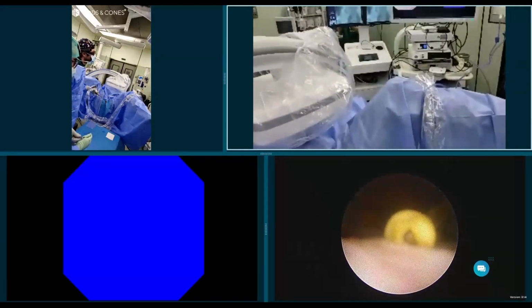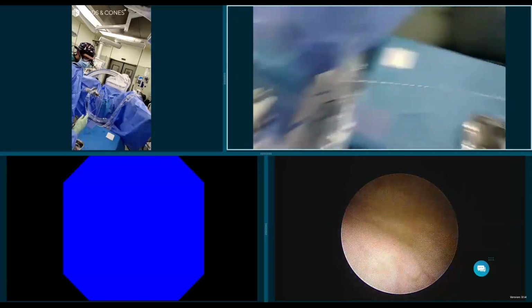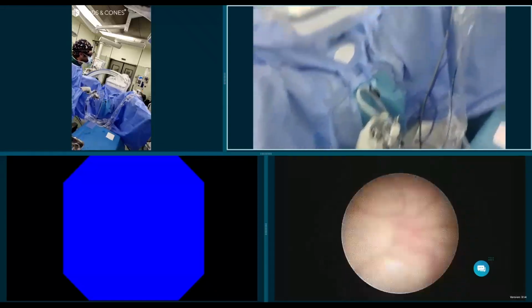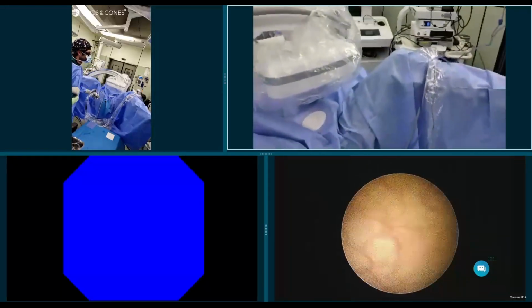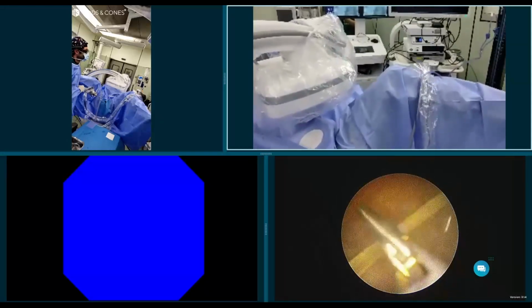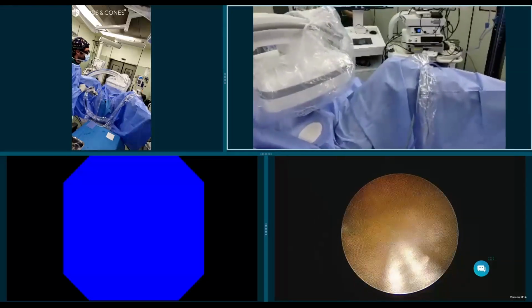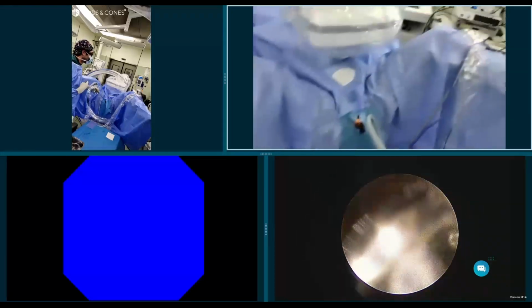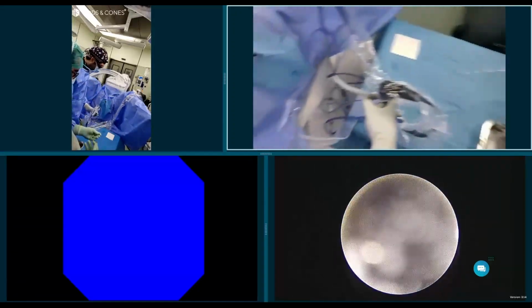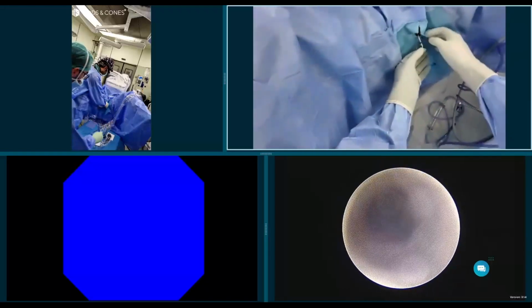I don't know if you saw that there's some incrustation inside the kidney. Let's take it out, and inside the stent, let's take it out and just see it either way, just to see what happens. So I grab the tip of the stent, I push it to the tip of my scope, and I remove it. You can see that here, removed perfectly. Thank you. You can leave it.